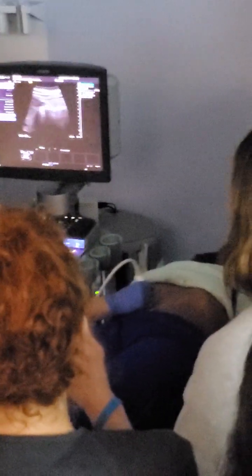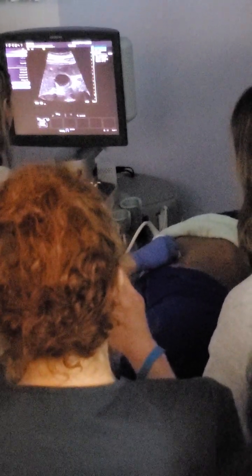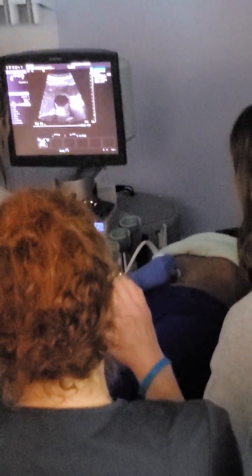And that was our body. The last one we're going to do, the funnest one. And so as much liver window as I can get. So here's our fundus. Let's see if we can walk back a little bit. Liver window in here. Back to sag, make sure we're square. Here's our fundus. How's that feeling for you?